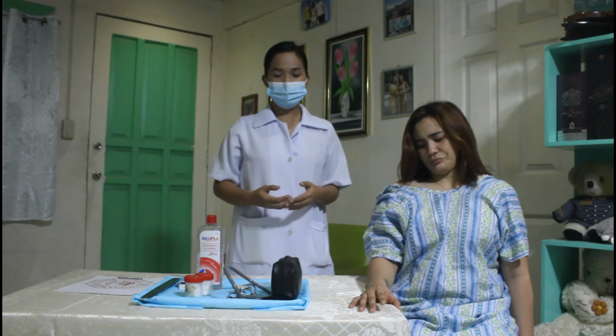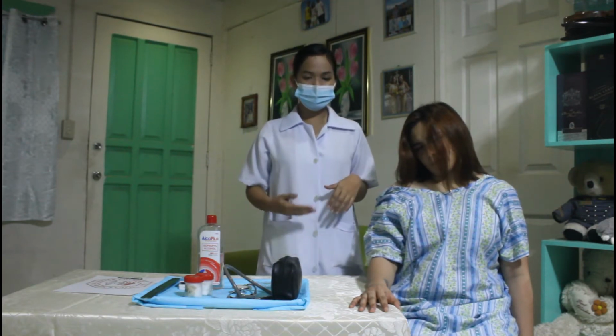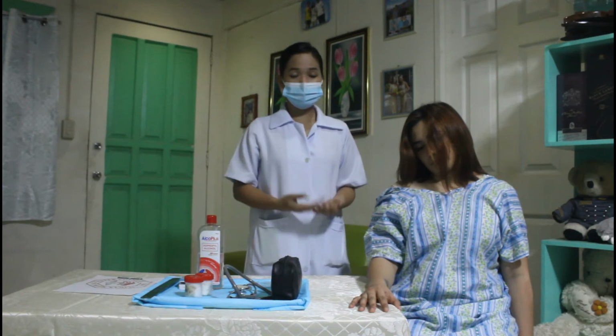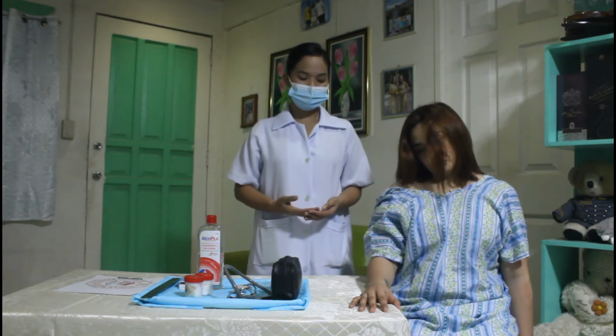Once it is already in position, we hold the thermometer probe in place until it makes a sound. The beep indicates the estimated temperature.